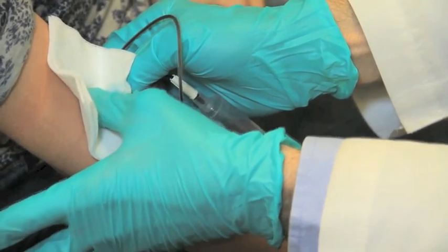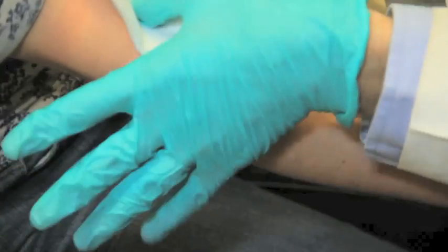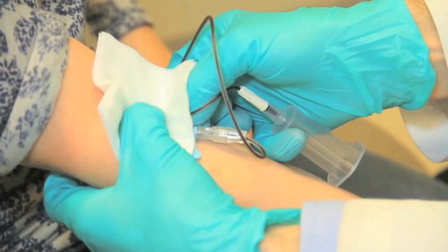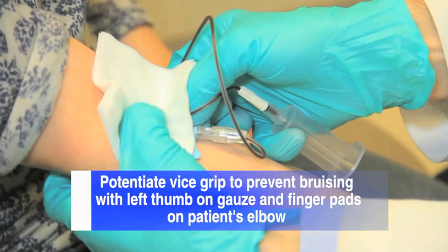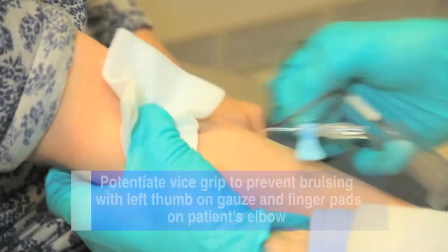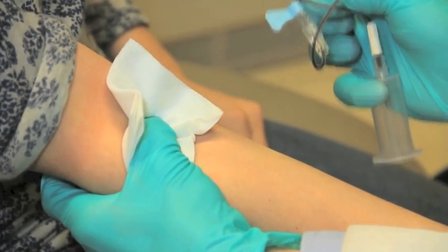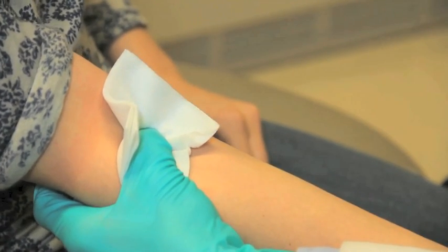Next, place gauze over the inserted needle without applying pressure. The gauze should be stabilized by your left thumb while the second, third, and fourth fingers are positioned at the elbow, potentiating a vice grip. Remove the needle and as soon as it is safely out of the way, exert pressure on the vein with the vice grip. The most common cause of bruising from phlebotomy is inadequate pressure upon needle withdrawal. When adequate pressure is applied, blood is less likely to ooze under the patient's skin in form of bruise.